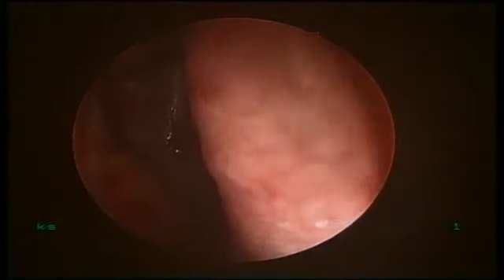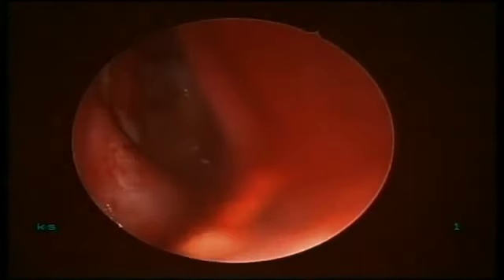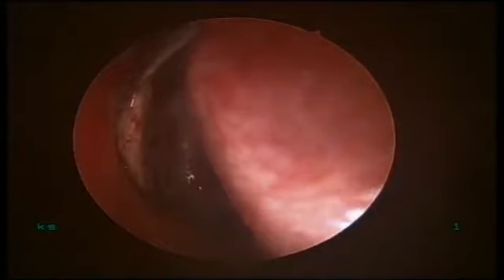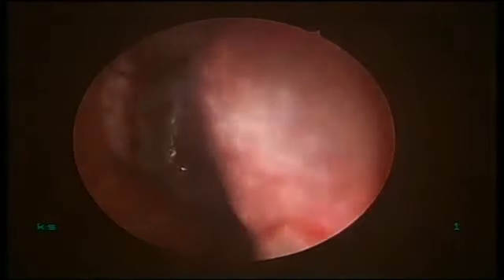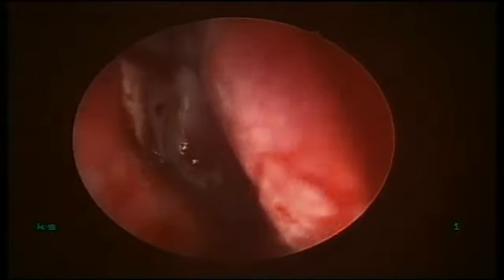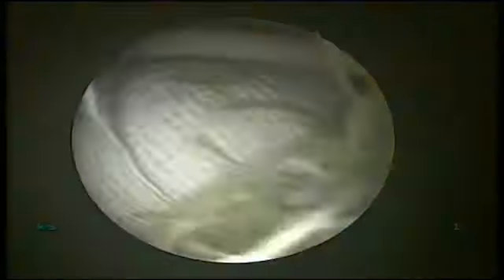And now I am joining these two incisions anteriorly like this. Can you see this? So this is a posteriorly based rhomboid shaped flap, which I am going to elevate now.